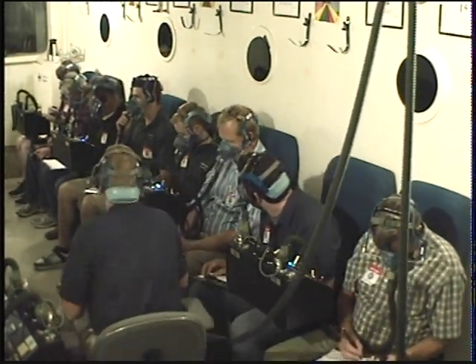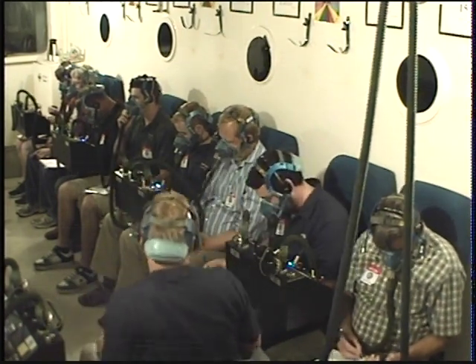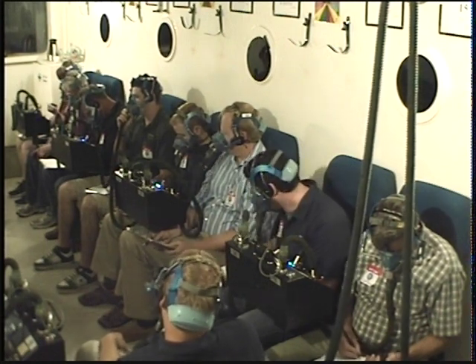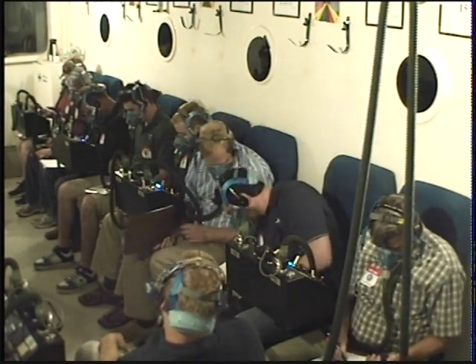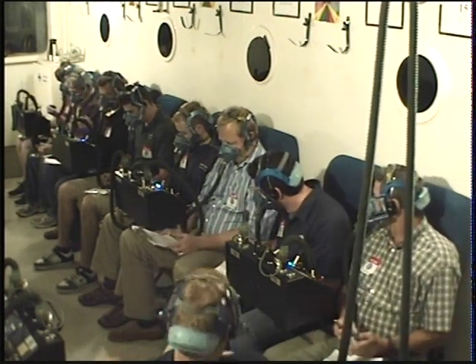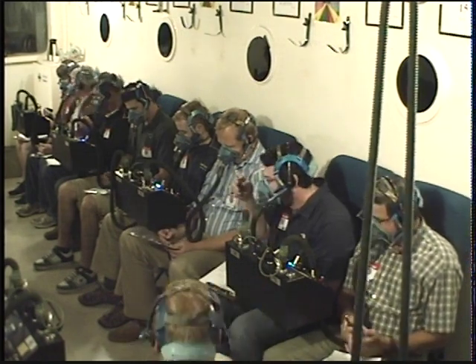Everybody on Brian's side, while we're waiting, if you'll go ahead and put your pulse oximeters on. And we're going to start on Shane's side. What I want to make sure is that everybody has slowed down their breathing rate, and that you're back to what you consider to be normal. So Shane, if you would come across intercom, are you back to what you consider to be normal? Not quite, all right. Make sure you watch that breathing rate. Look at your flow indicator if you need to, and slow it down.